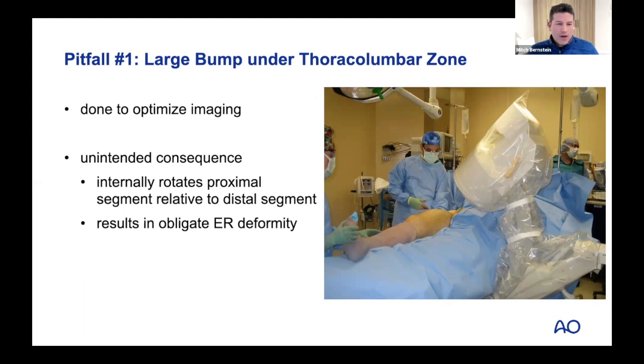It was not my idea. I forget who wrote it up, but putting a handle on the bump out of tape, and after the nail is in, I have the nurse pull out the bump, but it's not irritating for them. Number one, I tell them before, so they're prepared. Number two, there's a handle, so they don't have to crawl under. There's a handle that pulls out, so that's just a trick. If you bump it up too much and you're having an issue, you can just pop that bump out.